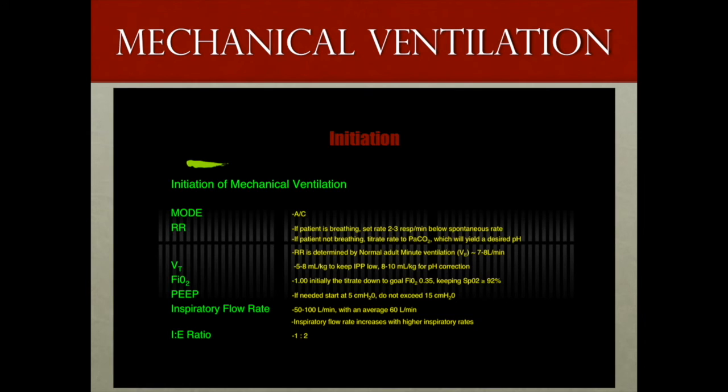water. Keep in mind that when a patient is not intubated, they have a certain amount of natural or physiologic PEEP, and this is generated by back pressure from natural anatomic structures such as the glottis, the tongue, the teeth, and the lips. When an ET tube is placed, these anatomical structures are bypassed, and this physiologic PEEP is lost. To recreate this, almost all patients are usually kept on 3 or 5 centimeters, more commonly, of PEEP. Going too high with PEEP can cause hemodynamic compromise and shunting.